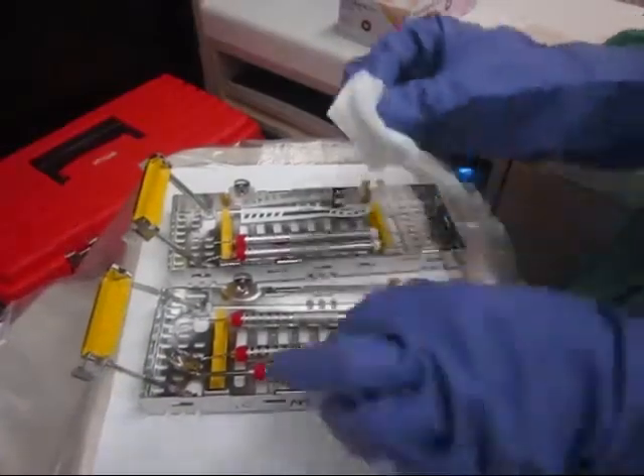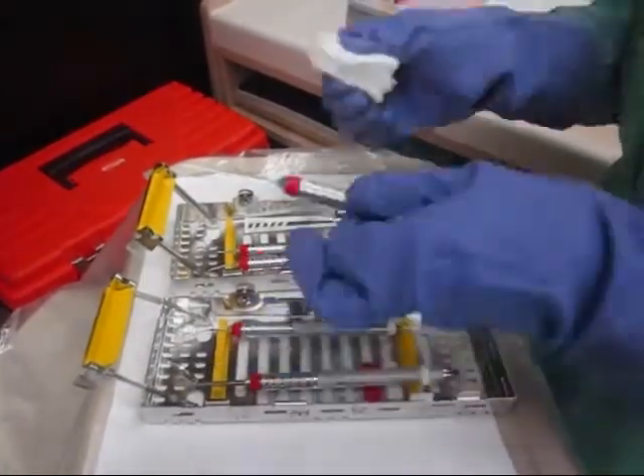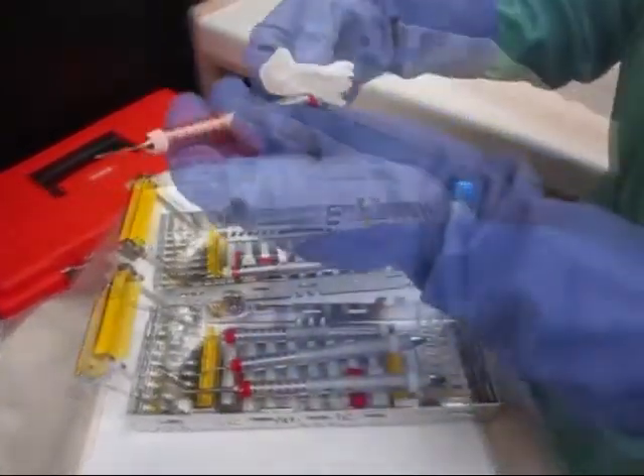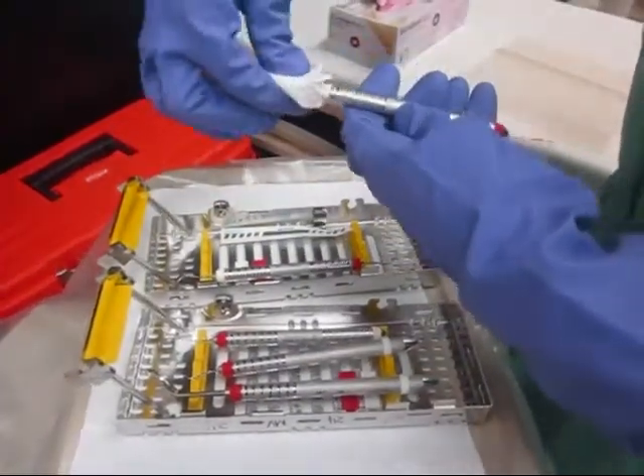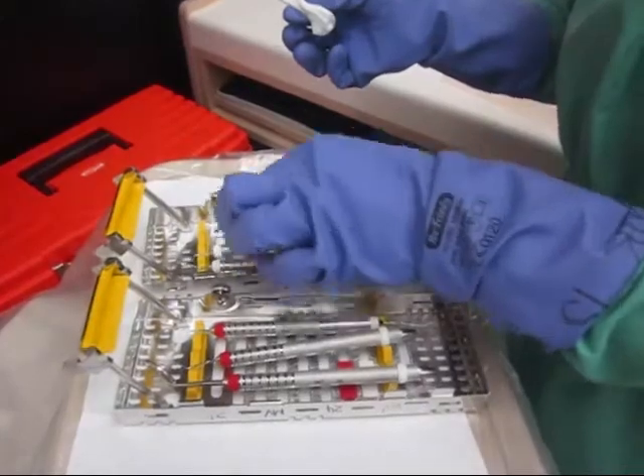Frances wipes visible debris from the instruments with gauze, carefully avoiding the sharp edges, making sure all instrument tips are facing toward the center of her cassette. Frances helps prevent damage to her instruments and accidental pokes by keeping the tips inside.